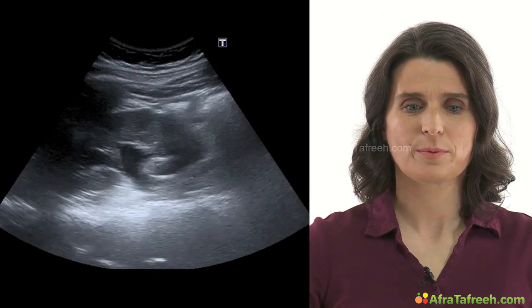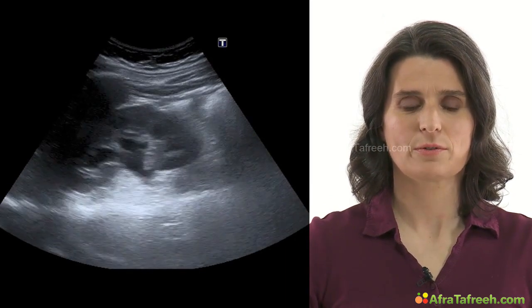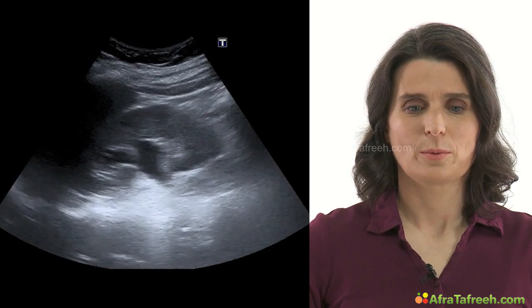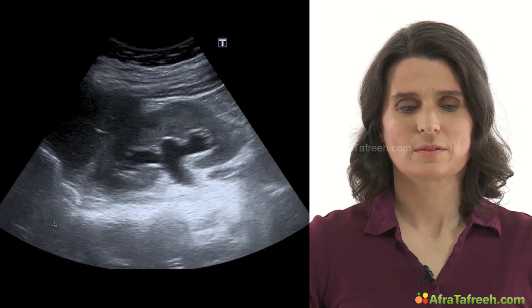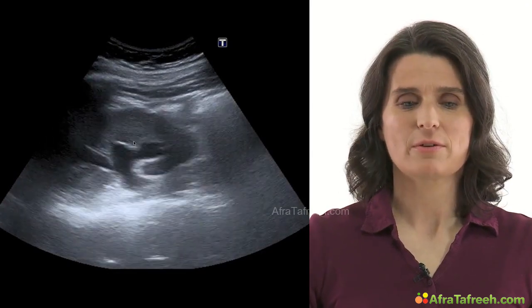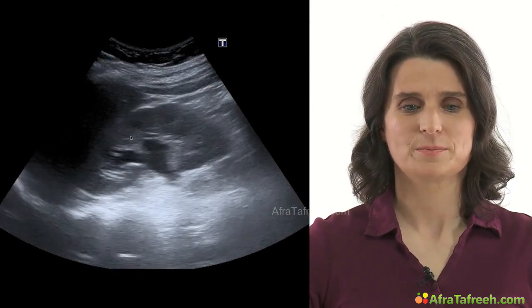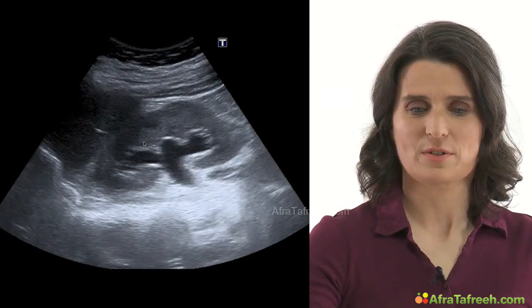Another video clip. So you can see hydronephrosis, and what you could detect here was that somebody was palpating. If the patient is feeling pain in this area, sonopalpation of a kidney with hydronephrosis.